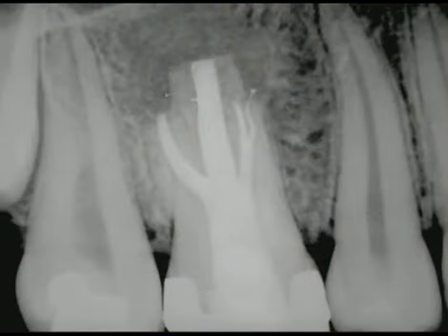A clinical photograph shows the Endo 4 ultrasonic instrument trefining counterclockwise around the broken instrument, and subsequent documentation reveals the coronal displacement of the broken file. A 6-month recall radiograph demonstrates excellent progressive healing following the placement of resorbable barriers in the palatal and DB canals. Barriers allow for controlled and hydraulic 3-dimensional obturation.